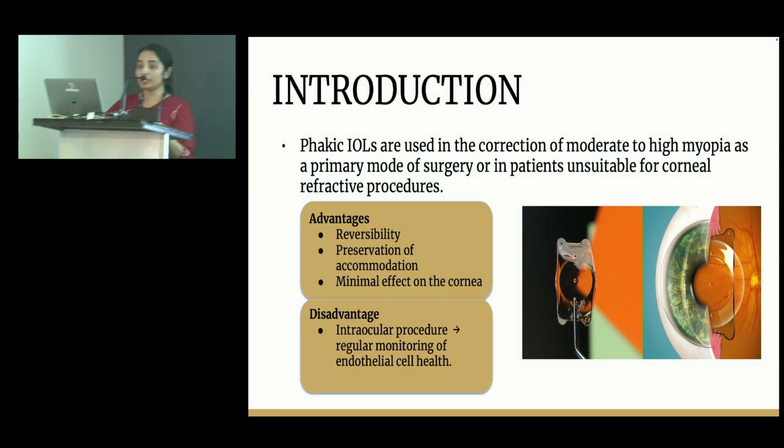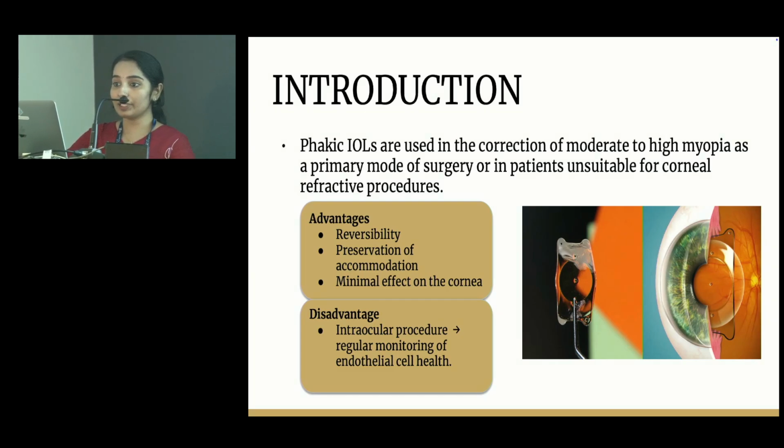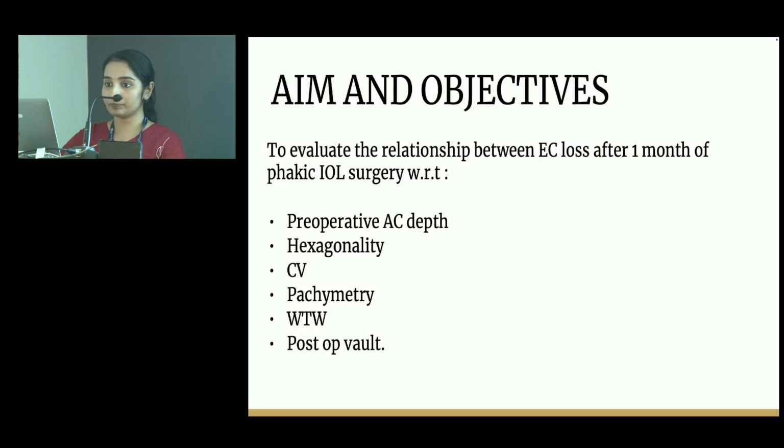As we know, phakic IOLs are used in the correction of moderate to high myopia as a primary mode of surgery or in patients unsuitable for corneal refractive procedures. It offers several advantages like reversibility, preservation of accommodation, and it has a minimal effect on the cornea. But since it is an intraocular procedure, regular monitoring of endothelial cell health becomes necessary.